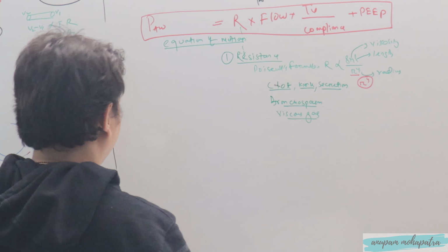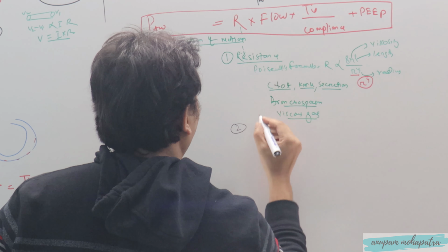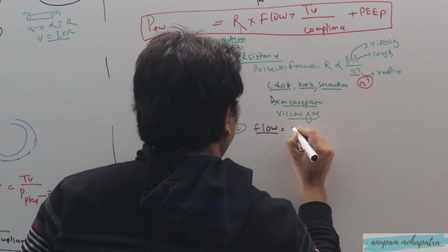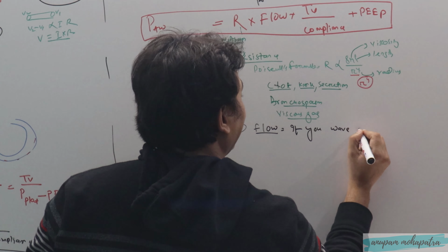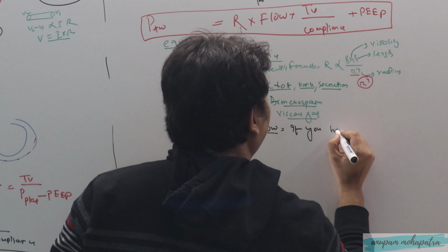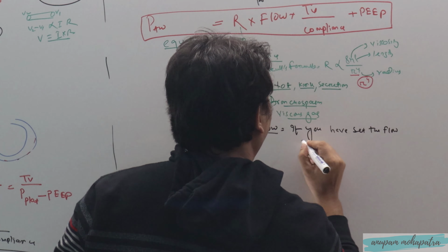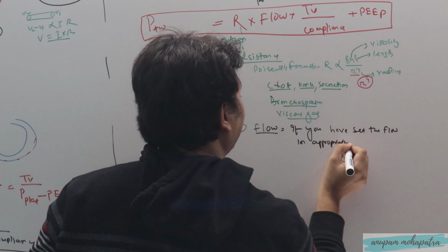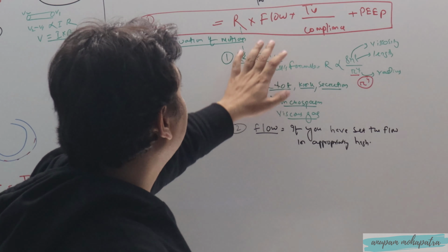Second is flow. If you have set the flow inappropriately high. Now one thing you have to remember, the flow is fixed.